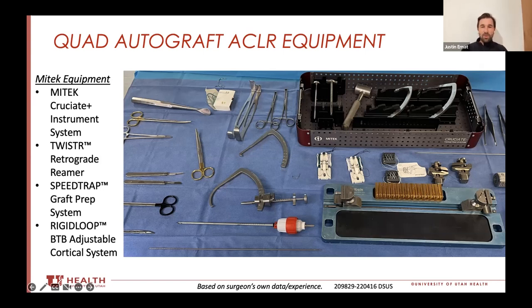This became really apparent for me when I was a surgeon in the army. In the operating room it would simply be me and one single scrub tech. Our scrub techs weren't very proficient at using the camera, so I would position the guide, ratchet and lock it into place, then let go of the guide. I'd be holding the camera in one hand and the drill in the other, basically soloing the tunnel drilling for the ACL.